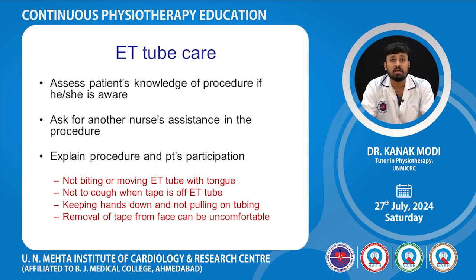ET tube care. Assess the patient's knowledge of the procedure, whether he or she is aware. Ask another nurse for assistance in the procedure. Explain the procedure and patient participation: not biting or moving the ET tube with the tongue, not coughing when the tape is taken off the ET tube, keeping hands down and not pulling off the tubing. Removal of tape from the face can be uncomfortable.